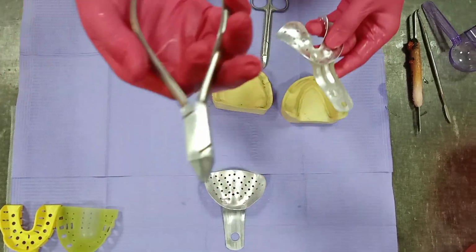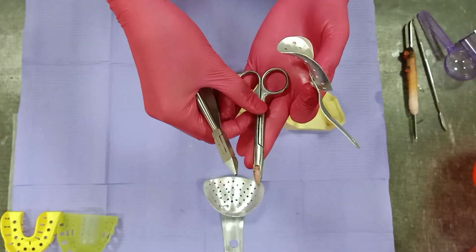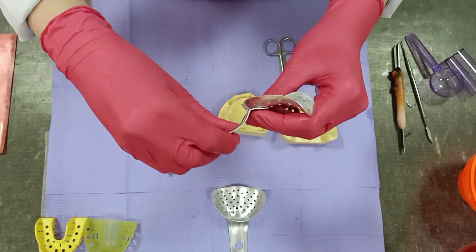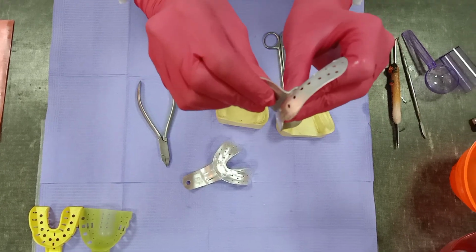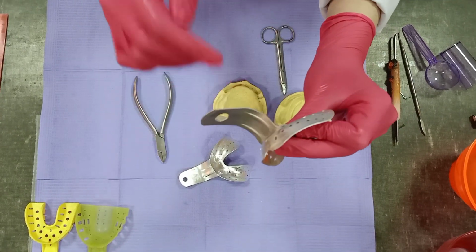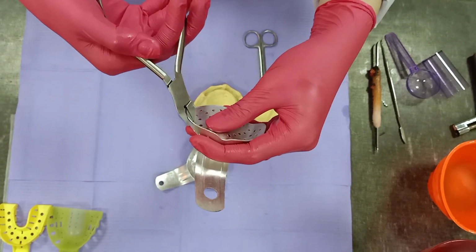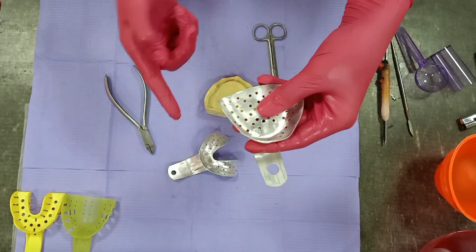Now let's do our modification of the tray. For the modification of the tray, we are going to first bend the handle in the form of an L shape, the lower and the upper, to facilitate the trimming in the patient's mouth. After that, we are going to use the pliers to either bend the tray inward or outward. Bending is the first step in the modification of the tray.